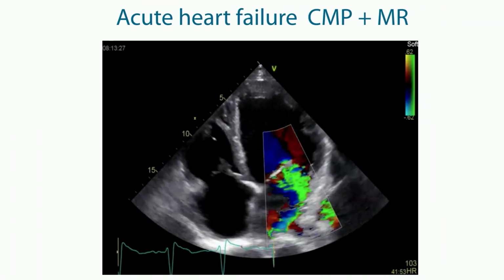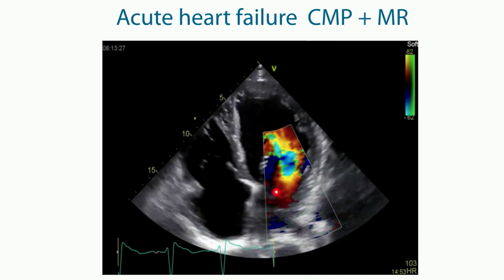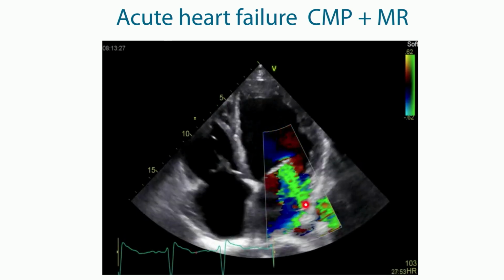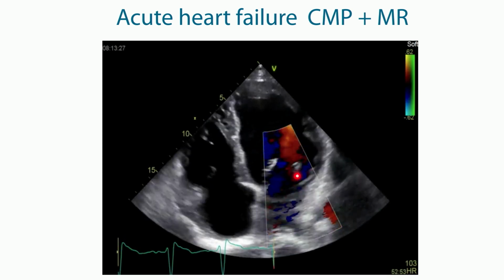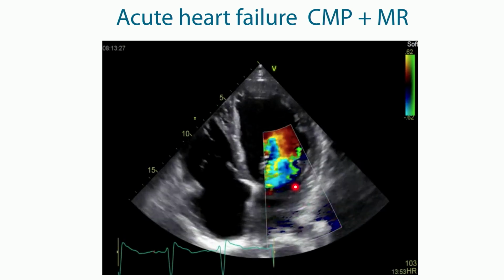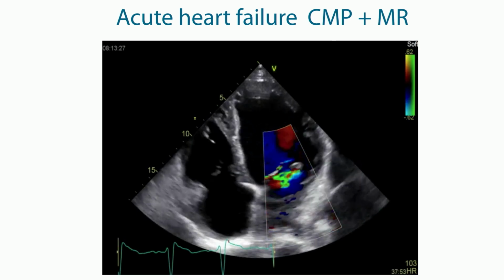With point-of-care ultrasound, we visually assess left ventricle function, and we are able to differentiate patients with severe from those with normal ejection fraction. But there are other pathologies we can detect as well, especially if we add color Doppler. What we can see here in this case is severe mitral regurgitation. You see a jet over here, aliasing, so the rapid change in red and blue color.